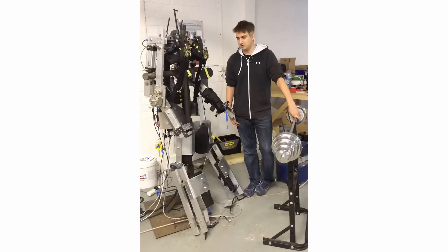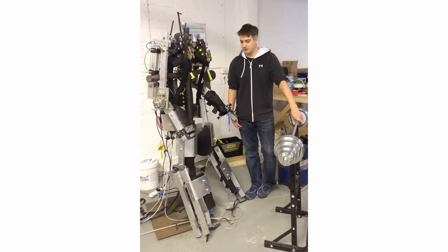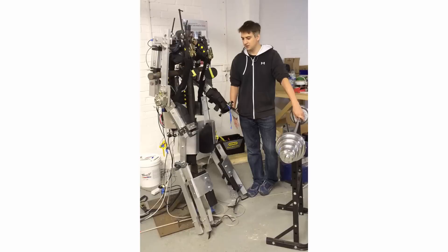It uses muscle sensors and pressure sensors to sense my motion. It's currently powered by pneumatics, which are a little weaker than the intended hydraulics, but for proving the concepts, that's what we use.